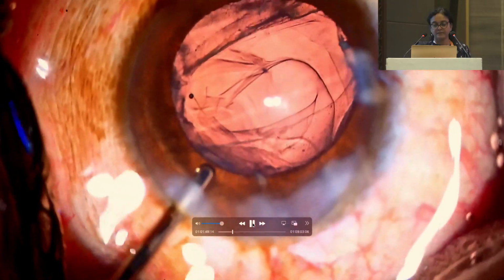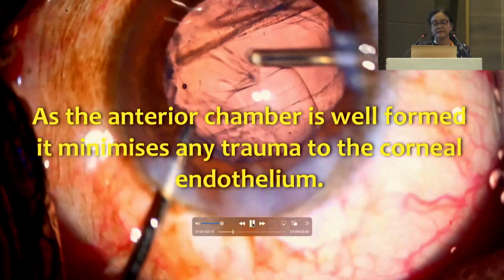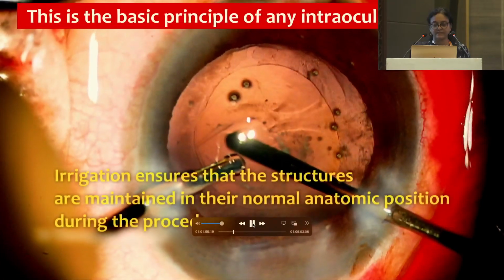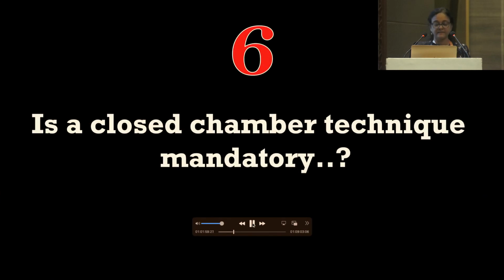But we need to be careful about what kind of irrigation we need. It should be titrated such that it does not disturb the anterior chamber. It ensures that the structures are maintained in the normal anatomical way.